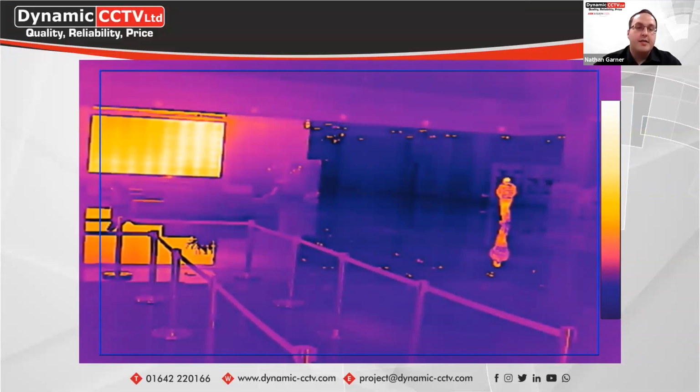They can have this as an overall screening method. If someone triggers an abnormal temperature, that's not saying that they have a fever. It's more of a first stage screening method, and then that would need to be checked with a thermometer or something like that to confirm the high temperature. But it's used as a mass screening for this kind of solution.